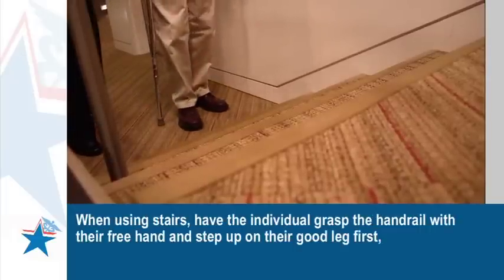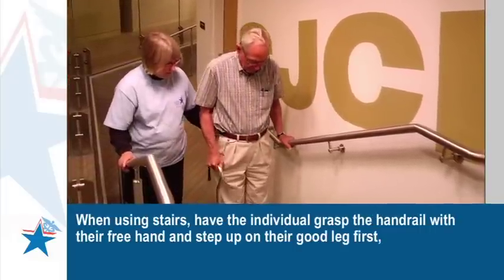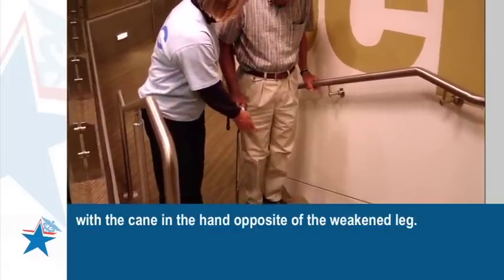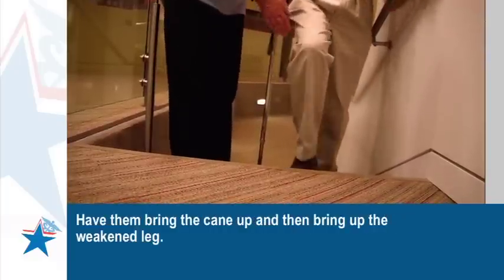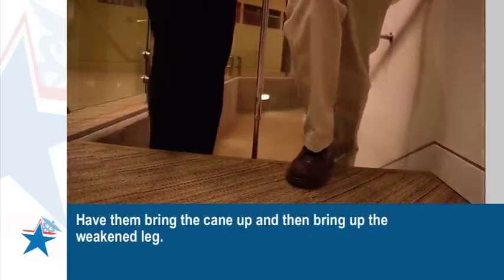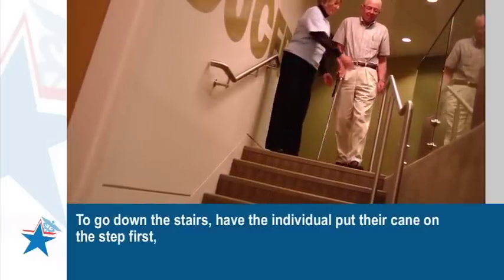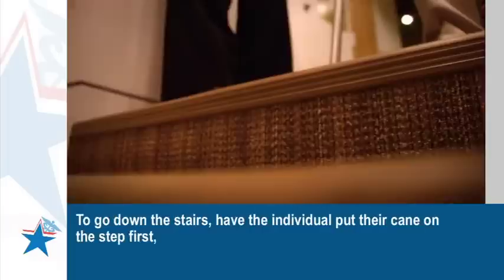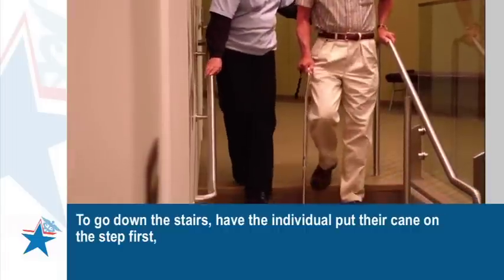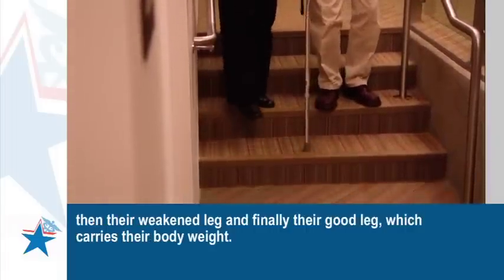They should look forward and not down at their feet. When using stairs, have the individual grasp the handrail with their free hand and step up on their good leg first, with the cane in the opposite hand of the weakened leg. Have them bring the cane up and then bring up the weakened leg. To go down the stairs, have the individual put their cane on the step first, then their weakened leg, and finally their good leg, which carries their body weight.